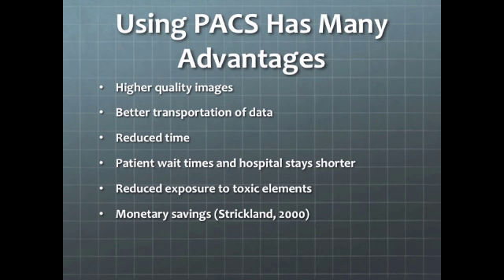Patient wait times are reduced and hospital stays are shorter. Prior to PACS, patients had to wait for the film to process to judge the quality of the image, and sometimes additional films would be needed. Patients will receive less radiation exposure from X-ray equipment, and it reduces the amount of incidences of patients having adverse reactions to contrasting dye.